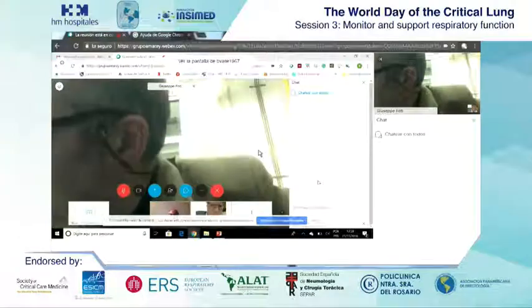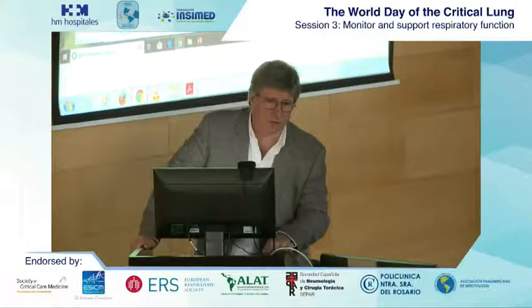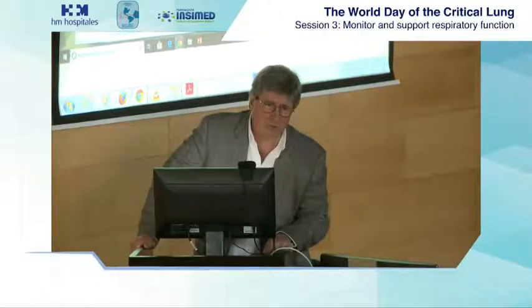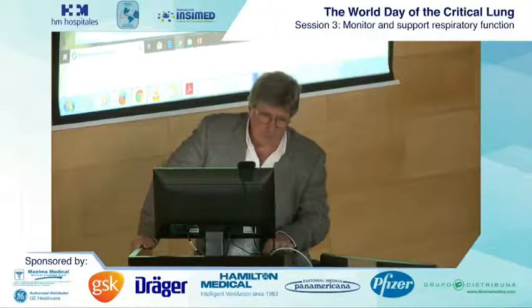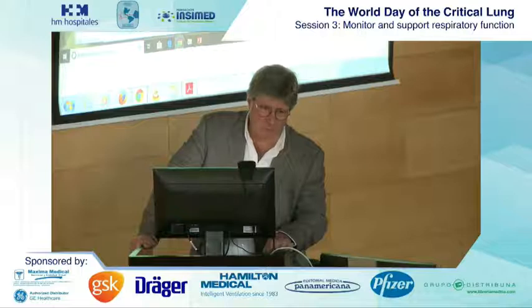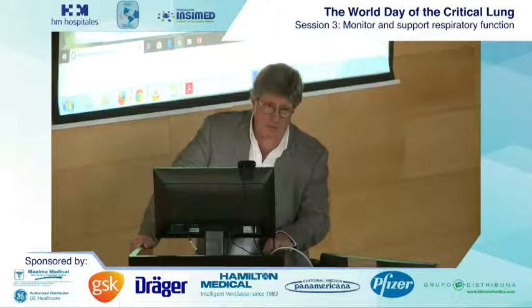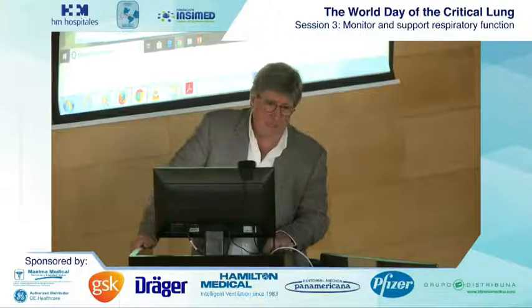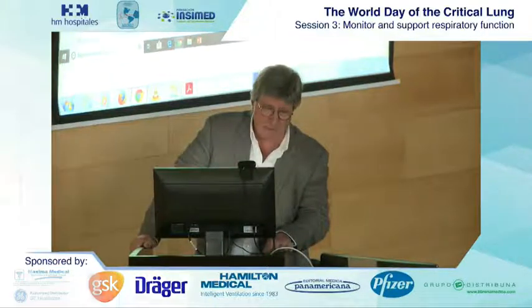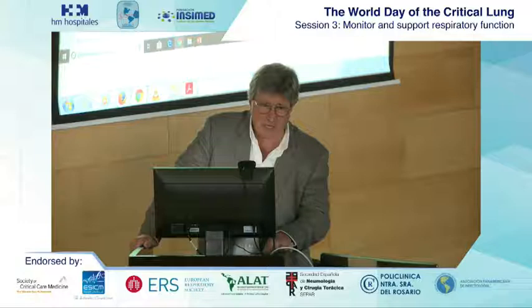No, that's fine. Bruno, just a short question for you. Are you worried that in people without ARDS, if we use low tidal volume, if we force that patient to breathe at 6 mL per kilogram predicted, some of them have hypercapnia and maybe some kind of distress? What's your opinion about that?